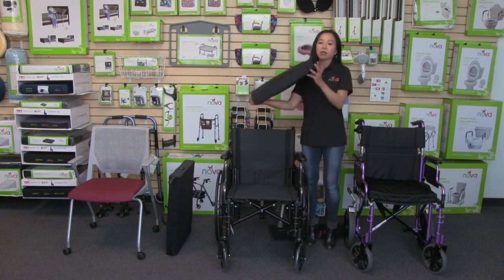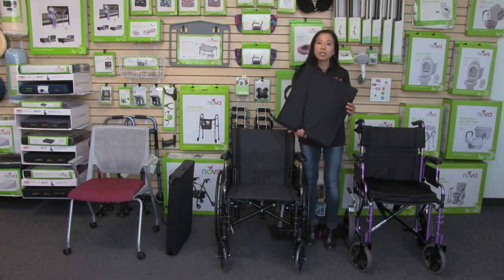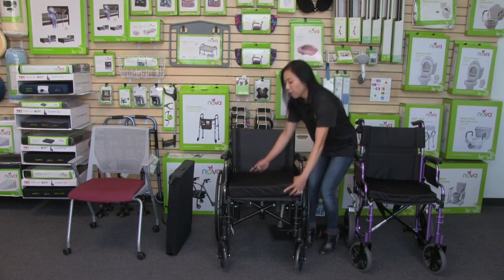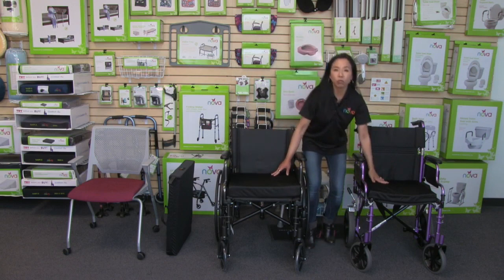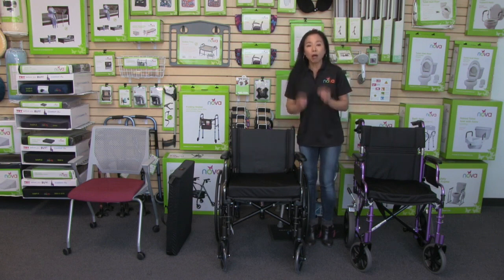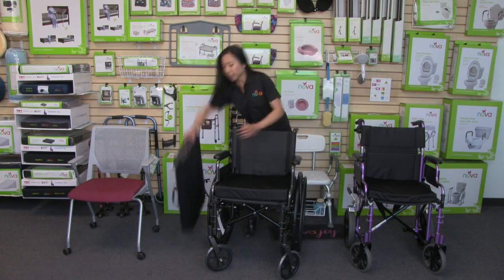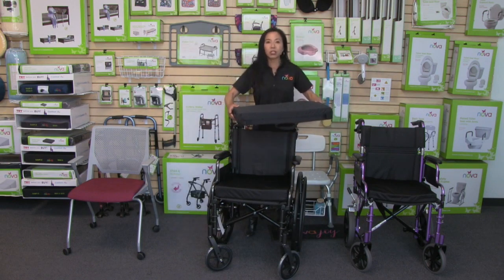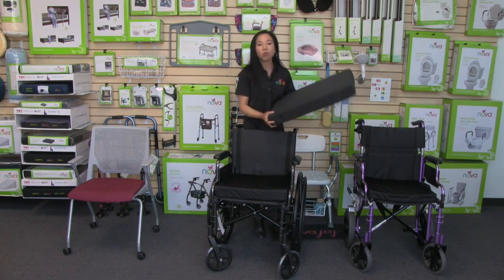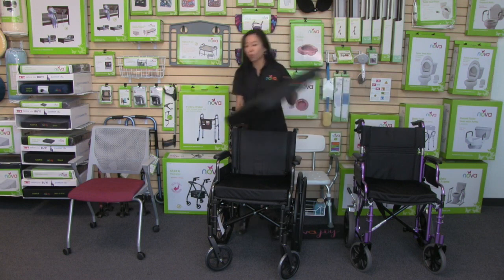This wheelchair cushion is very versatile because it comes in different sizes. This size here is the three-inch thick, and we also have a two-inch thick. Both the two-inch and three-inch are 16 inches deep, ideal for a wheelchair or transport chair, and they come in 16, 18, and 20 inch widths. We also have a heavy-duty option — a three-inch thick cushion with the same features — that comes in 22 and 24 inch widths with a 400-pound weight capacity.